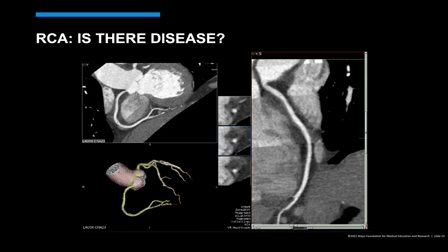So in patient selection, you can pick someone who has more of a regular rate. I know that we will generally treat our patients with a beta blocker, like metoprolol, beforehand to get their rates really low, and then encourage the patient to not move, especially during that exam.